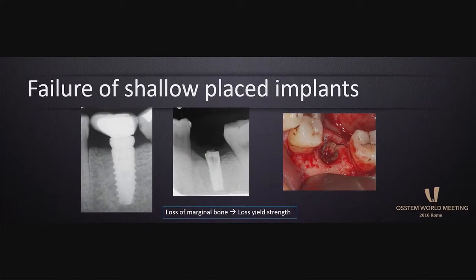Like this implant, it has bone recession. After some cyclic loading from the occlusal force, the implant itself even fractured and had to be removed. So we don't want to have this problem for our implants, right?